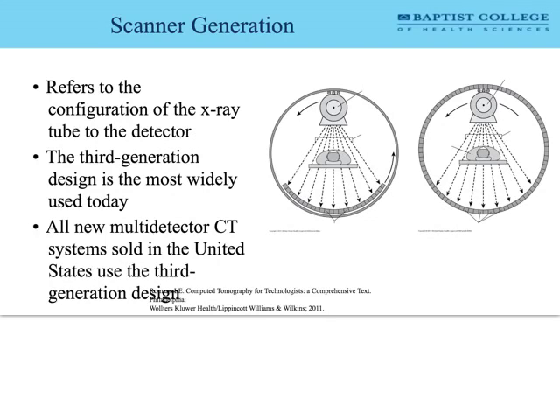Now, there was one question out there, I think, in one of our online quizzes that said something about fan beam and where it is associated with. It was initially developed for 2nd generation scanning, but we continue to use fan beam. We like fan beam. So 1st generation gave us the algorithm that we use. 2nd generation gave us the fan beam. 3rd generation gave us the fan beam plus the slip ring. And it's the one that we love. Every CT scanner currently being manufactured is a 3rd generation CT scanner.